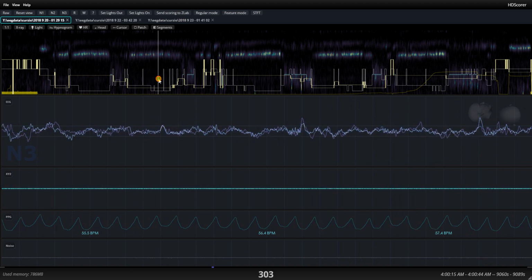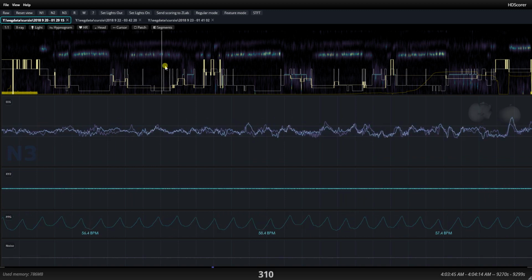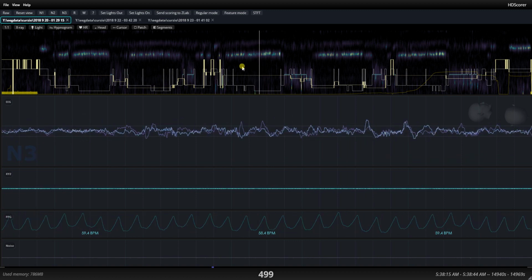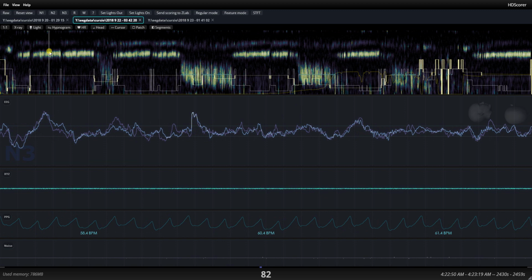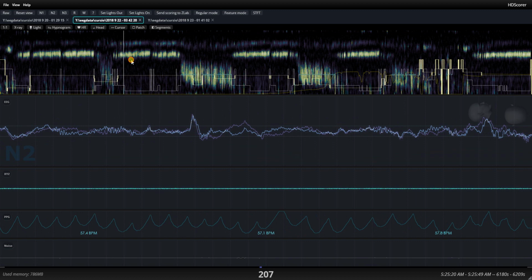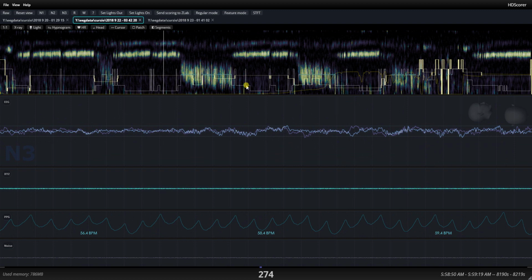How about here? Here I'm also to the left, and in fact my N3 sleep got delayed by a whole lot. This doesn't prove it, though, because you can't really draw inferences of this magnitude just looking at one recording, but the idea is you take a lot of them, and at some point you would be able to figure out something like that, like your best head position for sleeping. Here I was facing with my head to the right, and it seems I got more N3 sleep, and I got into N3 sleep more quickly. I'm used to sleeping on the right side, by the way.